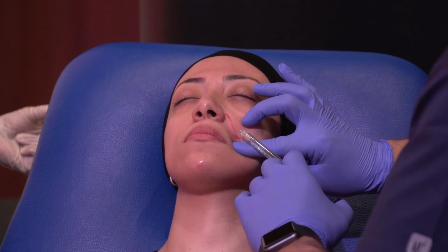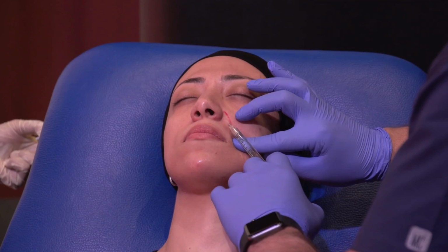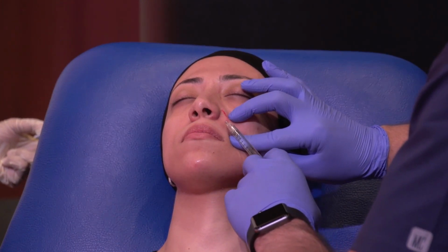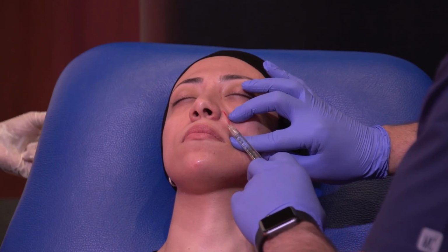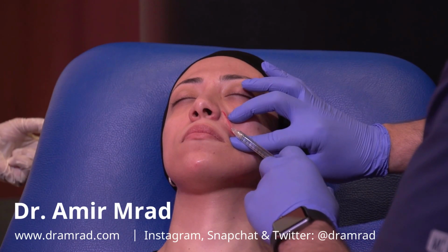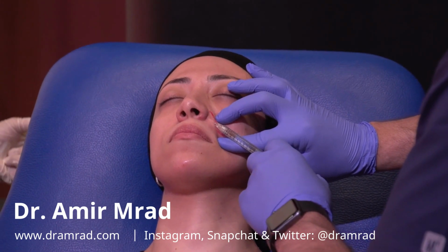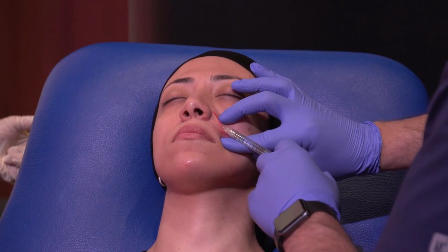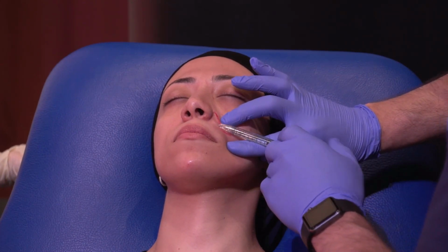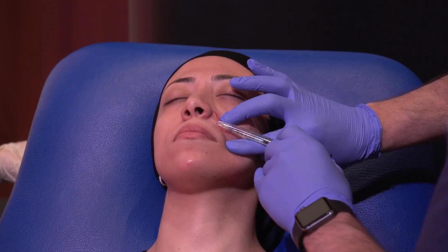Okay, I pull on the skin, one puncture hole, and then subcutaneous. I start with the angle, I aspirate, it's crucial to aspirate in this area, and then I inject as I'm pulling out. Usually in the nasolabial fold, I do a half cc. Every time I push in, I aspirate, and then I inject. Usually it's a half cc fanning technique. It's a little bit painful to the patient when you touch the muscles in the area.